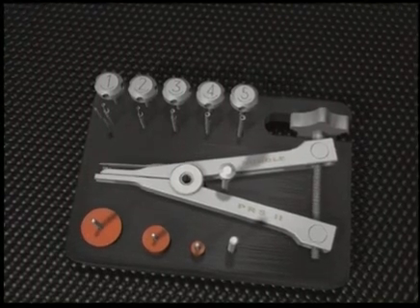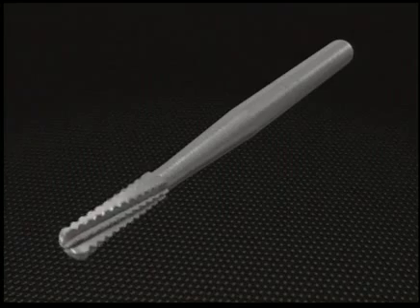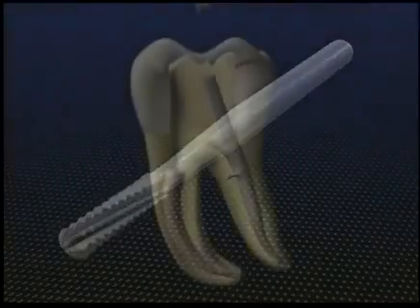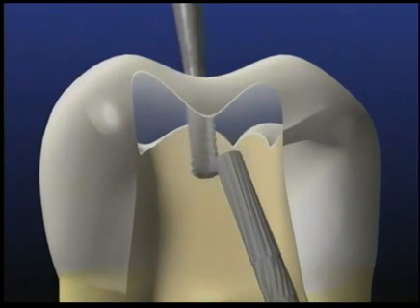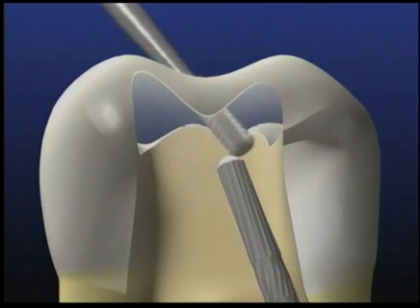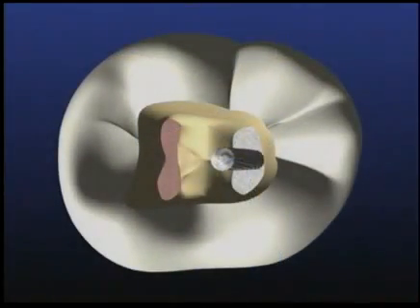When utilizing the PRS, the first step is to select a Transmetal burr. This friction grip burr fits into a high-speed handpiece and its sawtooth blades efficiently machine metal. The Transmetal burr chamfers and rounds off the coronalmost edges of the post. This is accomplished by moving the head of the handpiece in an orbital pattern above the post drill pivot point. The head of the post is now domed and will create a guide path for subsequent instruments.